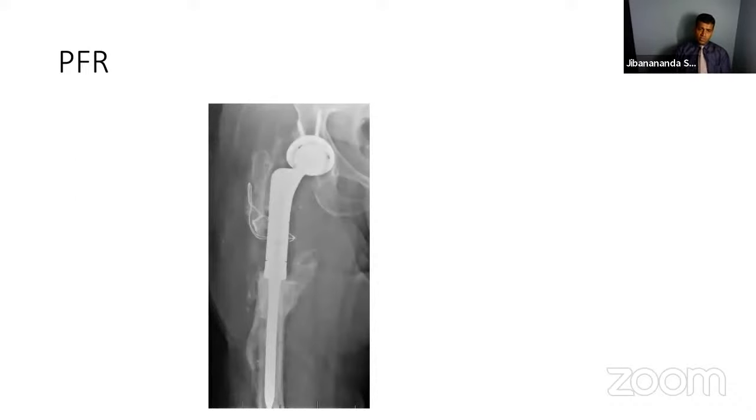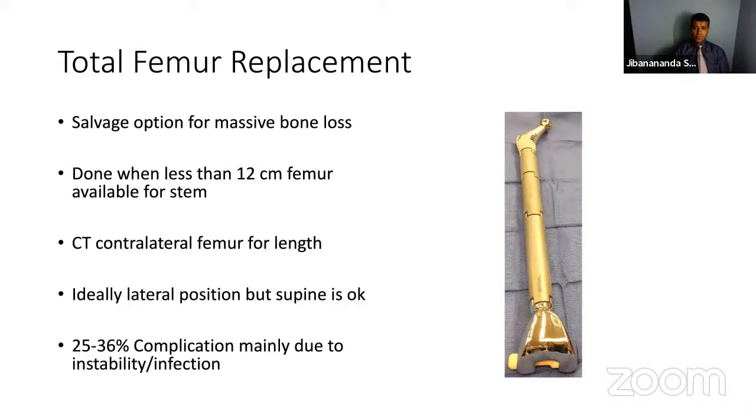Again, we chose to do a PFR on her. I typically preserve the trochanter for abductor function and wire it if possible. Again, I tried a figure-of-8 wire there. It held well. She's still doing well. She's 2.5 or 3 years out, and she's pretty happy with her construct.